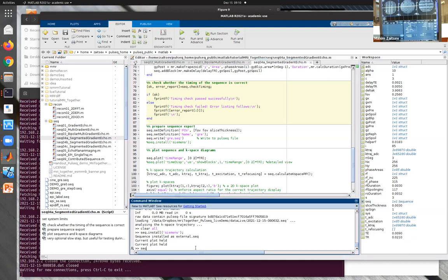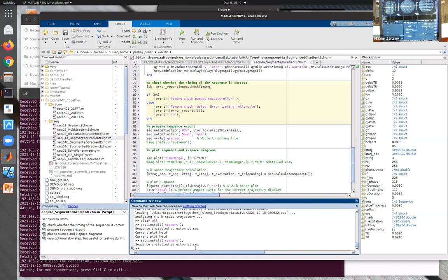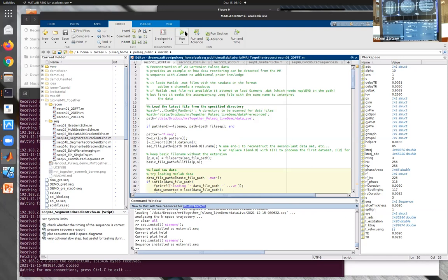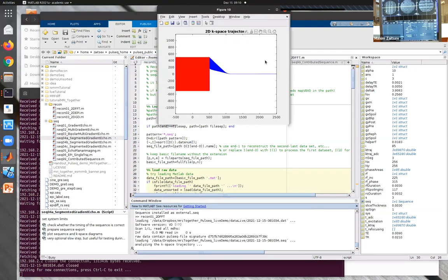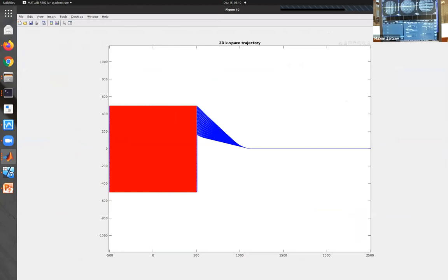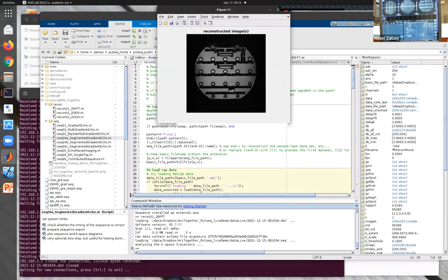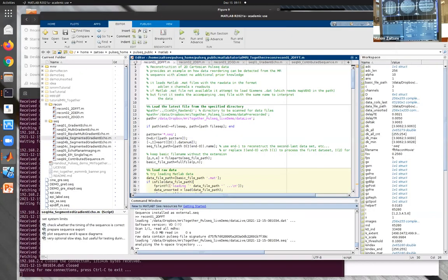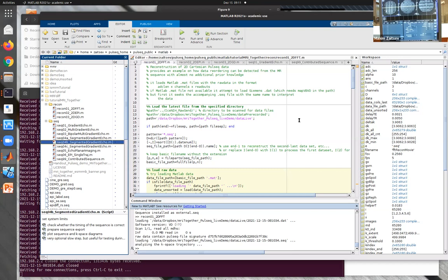And if we do install, you will see that the image quality is not so good now, and the reason for that would be that our readout bandwidth is relatively low. This phantom has relatively high inhomogeneity. So now our different readouts are affected by the inhomogeneities in different directions. If we increase the bandwidth of the sequence, that's a higher bandwidth version.